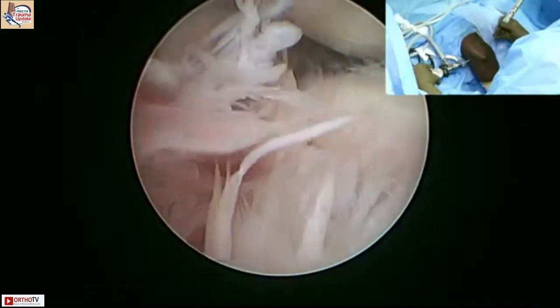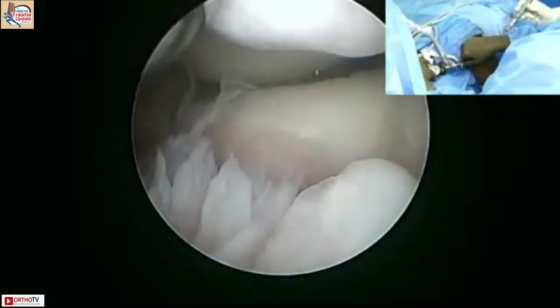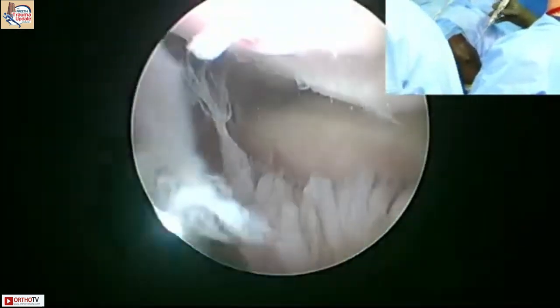Hold this there, give the elbow like that, okay? Yeah, good. So what we're going to do is a little bit of shaving.